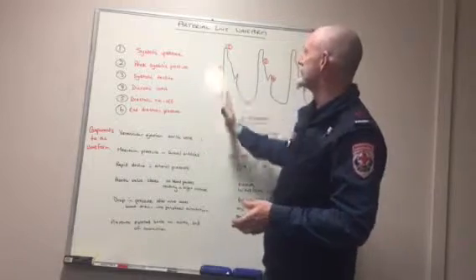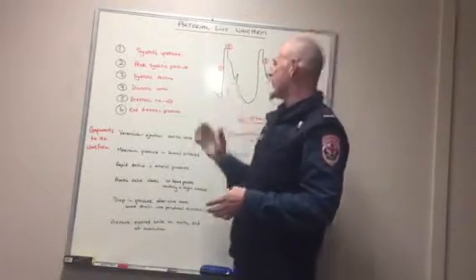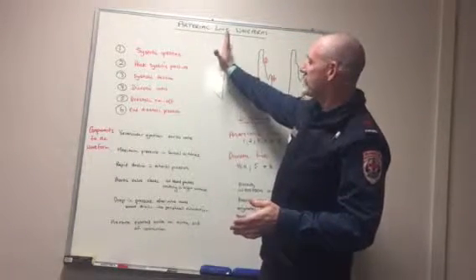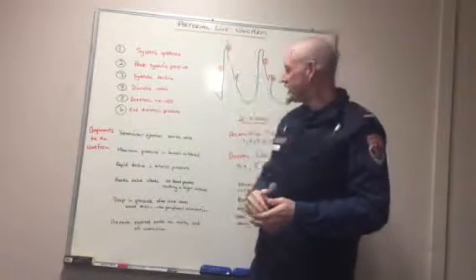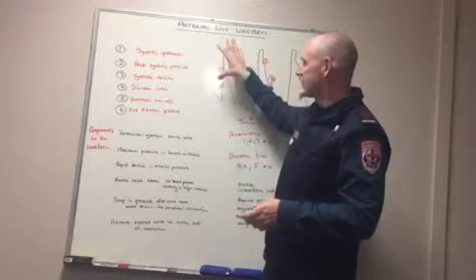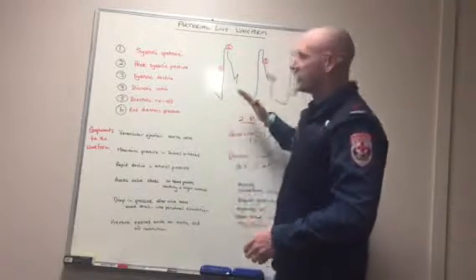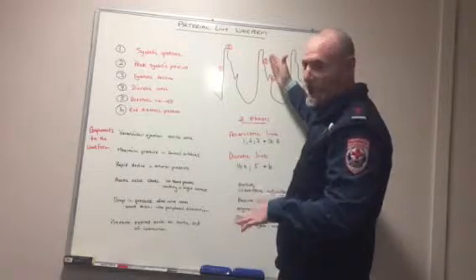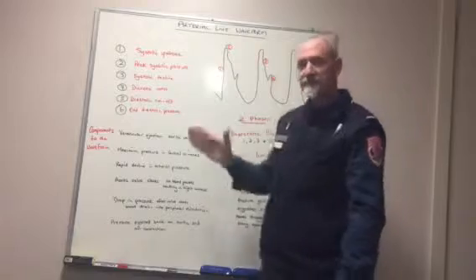What we're looking at firstly is the systolic upstroke. That is the ventricular ejection from the aortic valve. As that goes up, we get to the peak systolic pressure, which is the maximum pressure in the central arteries itself. As it starts to come down, we get to the systolic decline, which is a rapid decline in the arterial pressure.